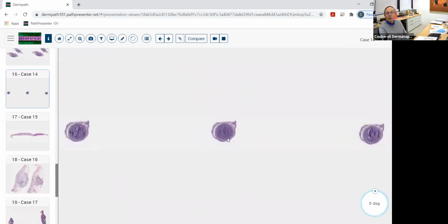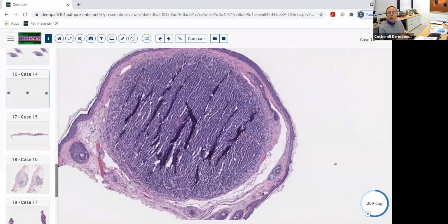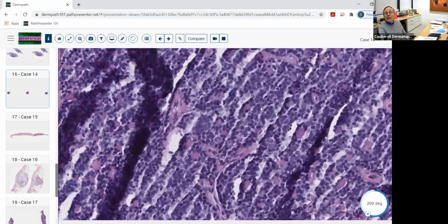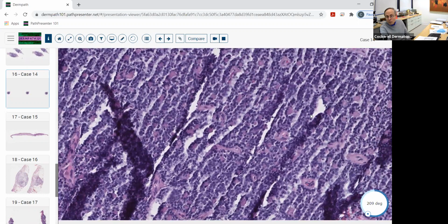So let's take a look at a spiradenoma. And the classic mnemonic device for this is a blue ball, or blue balls, multiple blue balls in the dermis. So blue little cannonballs in the dermis, think of spiradenoma. And then you've got higher magnification. Of course, it's got a lot of chatter artifact in here. It looks just exactly like those little small aggregations that we saw in the cylindroma a minute ago that had little small spiradenomatous elements to it, the small little pink hyaline droplets in here. You may get little small areas of ductal differentiation.